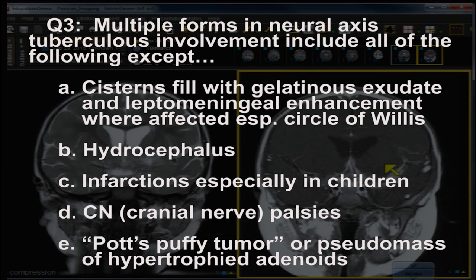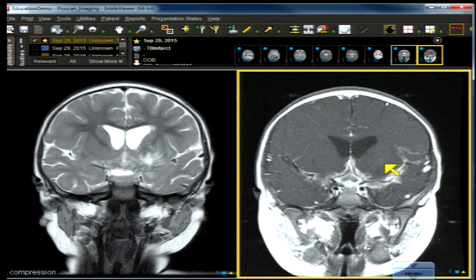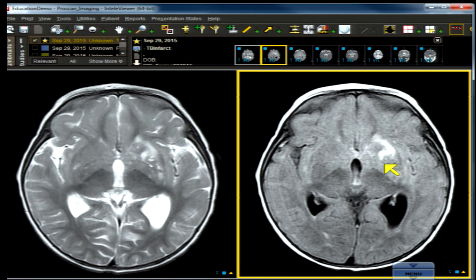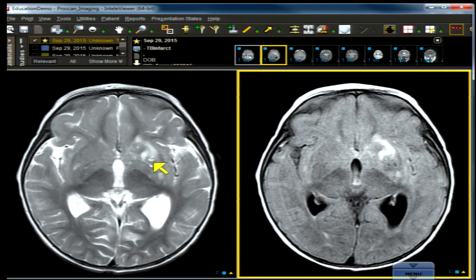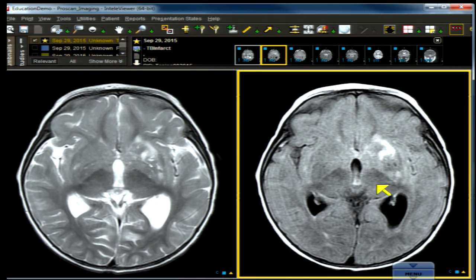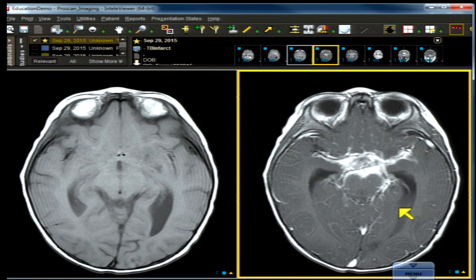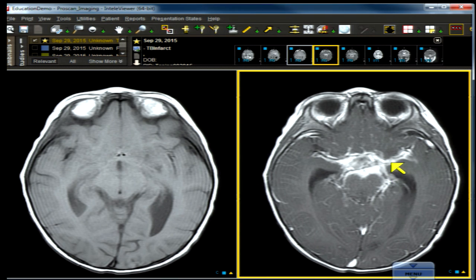Let's go back to our images for another look. In the left putamen and portions of the corpus striatum there is an ill-defined, non-mass-like pattern of hyperintensity which is corroborated on the FLAIR sequence, with little evidence of ventricular shift. The atria of the lateral ventricles may be a little dilated — we'll keep an eye on those, as we always should in any neural case. The pre- and post-contrast T1 MR are revealing.